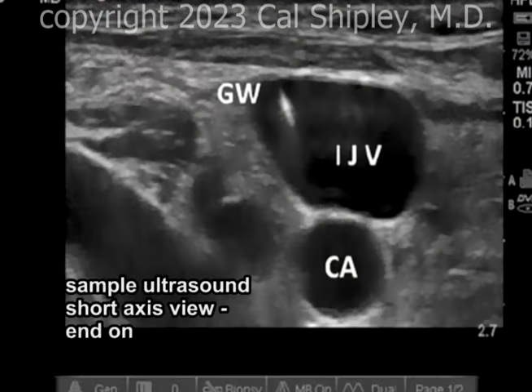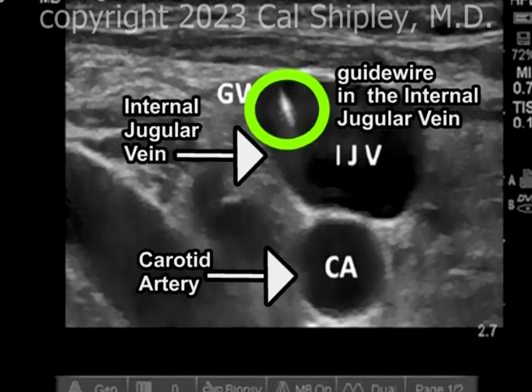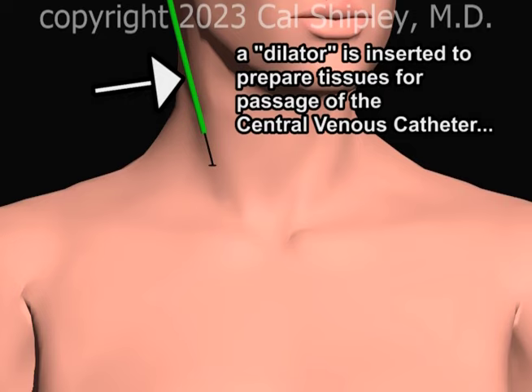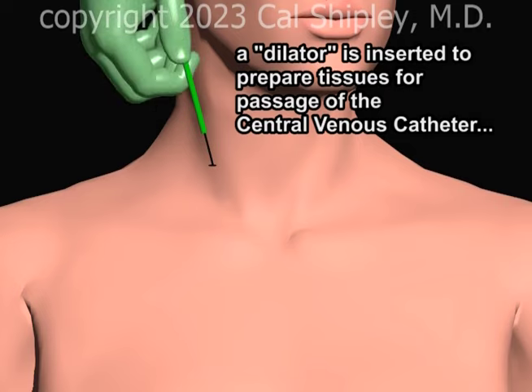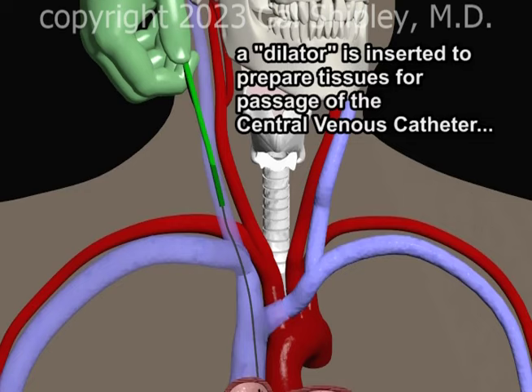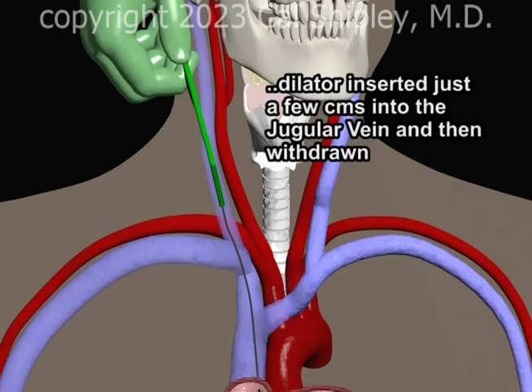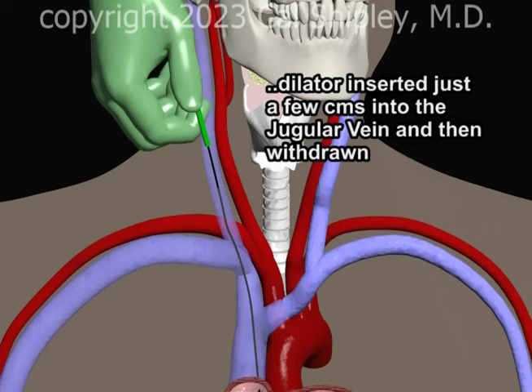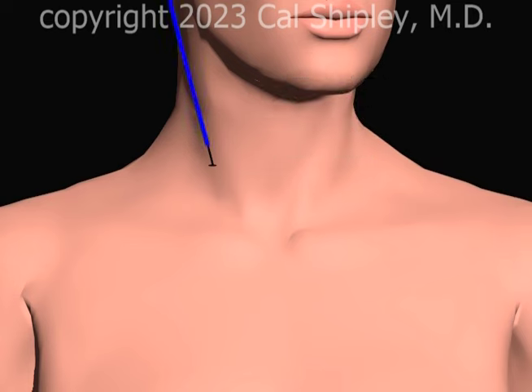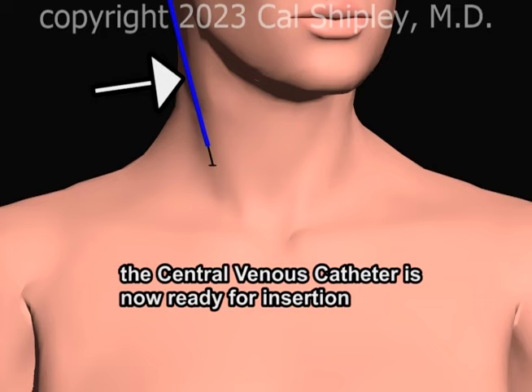A short-axis view, on the other hand, looks at a cross-sectional view of the vessels. A dilator is inserted over the guide wire to prepare the soft tissues of the neck for passage of the central venous catheter. Typically, the dilator is inserted just a couple of centimeters into the internal jugular vein and then withdrawn. The central venous catheter is now ready for insertion.